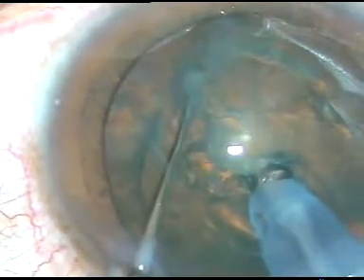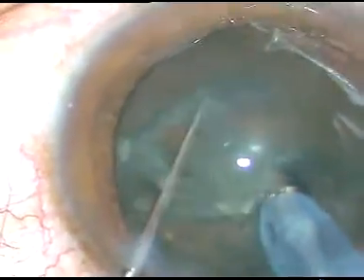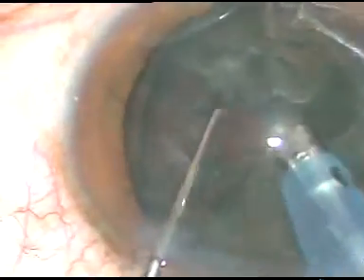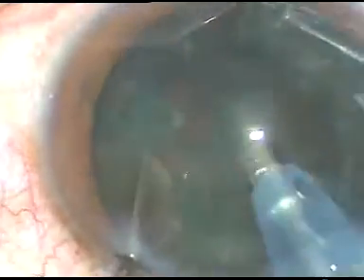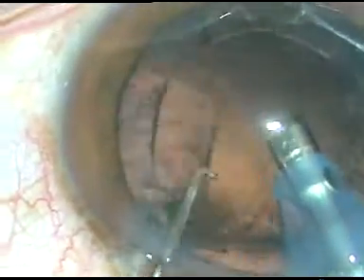The phaco tip is embedded and raised. I stop applying energy and vacuum, and now I mechanically slice the nucleus with the chopper — it is working well. I just support the nucleus and slice it with the chopper. In this case, the phaco power is only 40%, flow rate is 45 ml per minute, and vacuum is 450 mmHg. The nucleus and epinucleus have been removed.